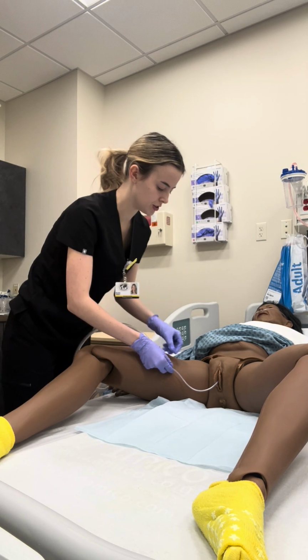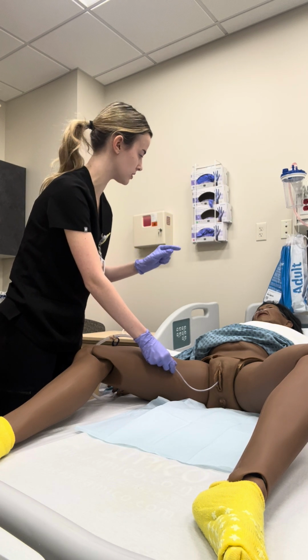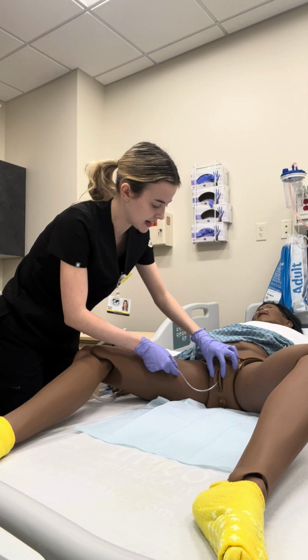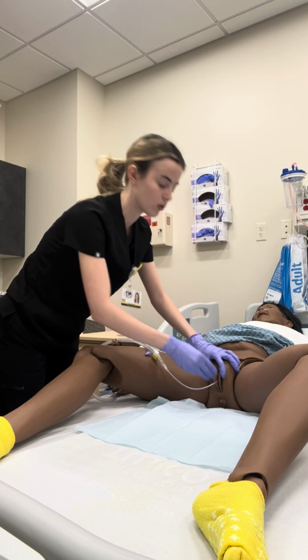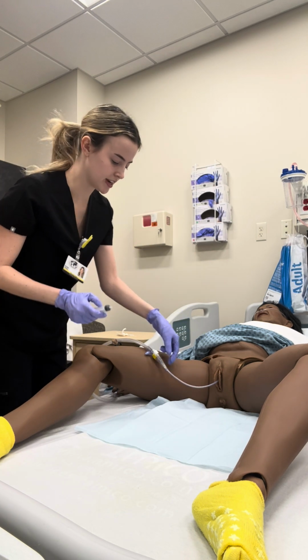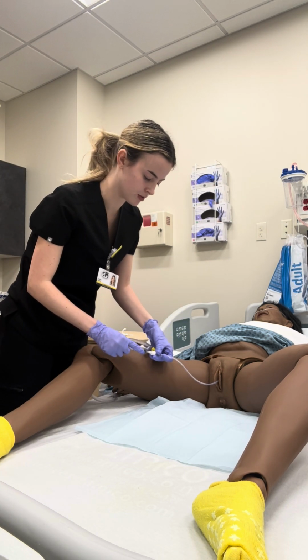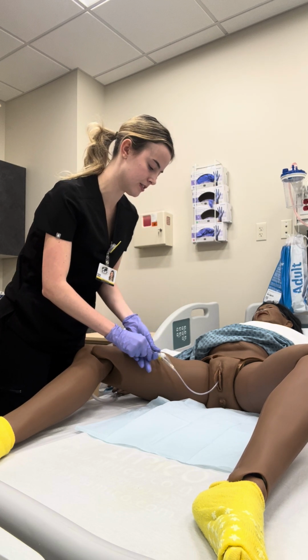And now I'm going to remove the catheter. So once again, I'm going to place my hand on your labia, okay? We're going to take out that catheter. Oh, I need to deflate. I would use my syringe to deflate the balloon before taking it out, so I felt that resistance first.